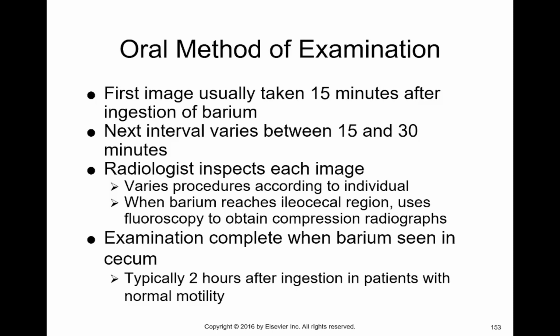So the radiologist should take a look at each one, but they may ask you just to present all of the images to them after the barium reaches the ileocecal valve. Of course, if you have a patient where the barium is moving really, really slow, then the radiologist is going to need to see that anyway.